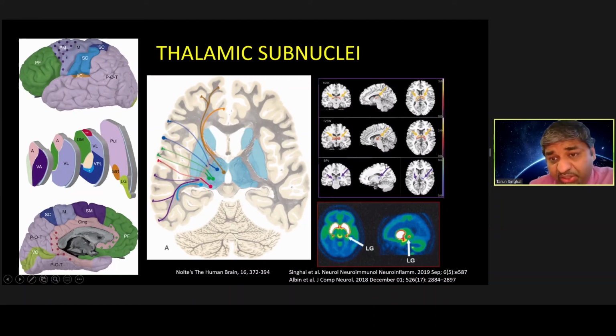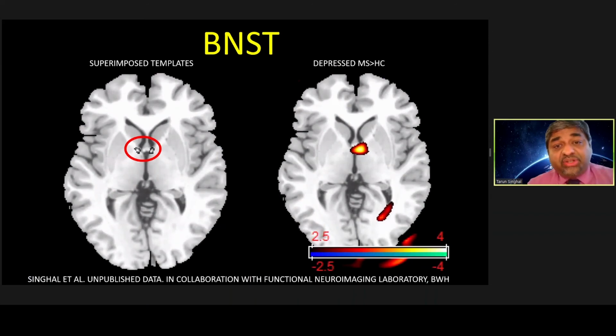And in our recent work using glial markers, we saw that specific areas of the thalamus were linked with either clinical measures of disability or with global brain atrophy. The vesicular acetylcholine transporter imaging that I talked about just now also showed this focal uptake in the lateral geniculate nucleus using the HR+. And clearly there is value in identifying these nuclei using a high resolution molecular imaging technique.